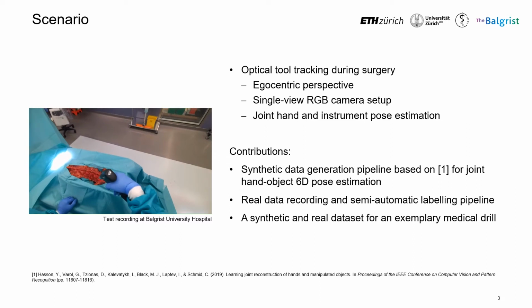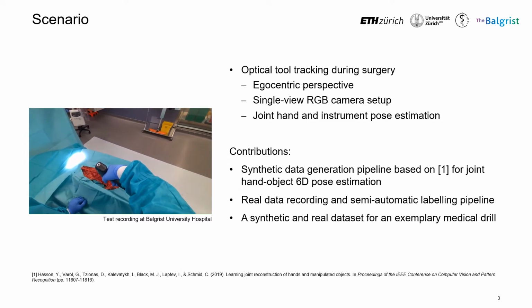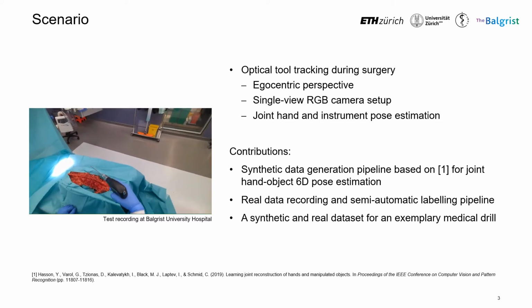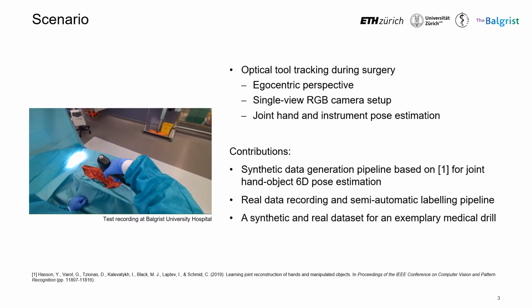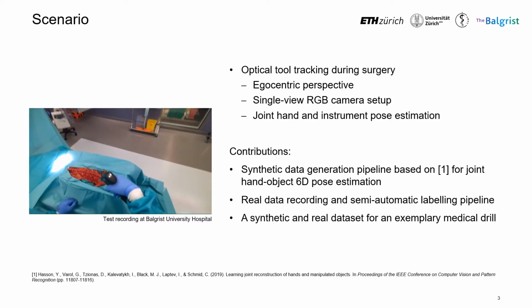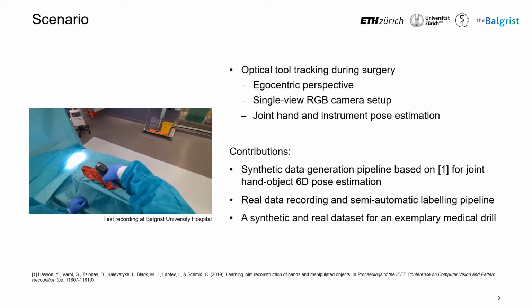In this paper, we focus on visual pose estimation of surgical instruments in the operating room. For this scenario, we assumed an egocentric perspective because a head-mounted camera provides a close and unobstructed view on the instruments and the incision without obstructing the surgeons in any way. Also, this perspective allows us to later deploy the tracking system on a mixed reality device such as the HoloLens.